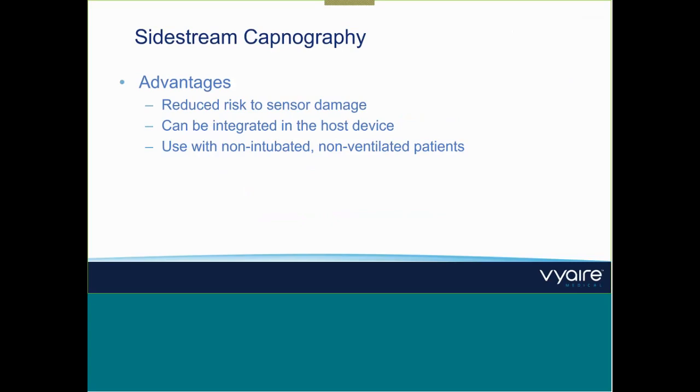You can just access the cockpit, and when you have a patient maybe on just oxygen therapy with a special prong with CO2 measurement, you can also use the sidestream capnography and have CO2 measurement while the ventilator is not in use or not running. It can be in standby. Same also for SpO2. So you don't have to ventilate when you want to have SpO2 or CO2 measuring on the Bellavista.